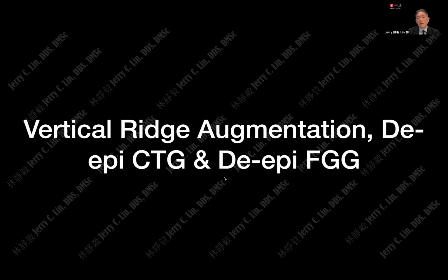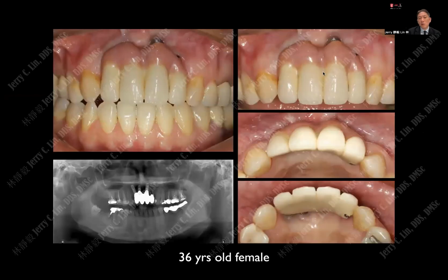The next case is vertical ridge augmentation, of course with some soft tissue issues as well. A 36-year-old lady came in with massive destruction of the aesthetic zone. How do we get to the aesthetic-looking result? First of all, we need to solve the bone problem and the soft tissue problem.